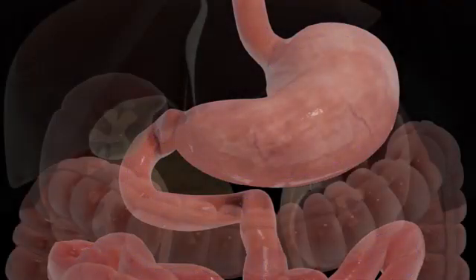The single anastomosis duodenal switch, or Loop DS, begins with a sleeve gastrectomy in which a thin vertical sleeve is created using a stapling device. This sleeve will typically hold between 100 and 150 milliliters and is about the size of a banana.